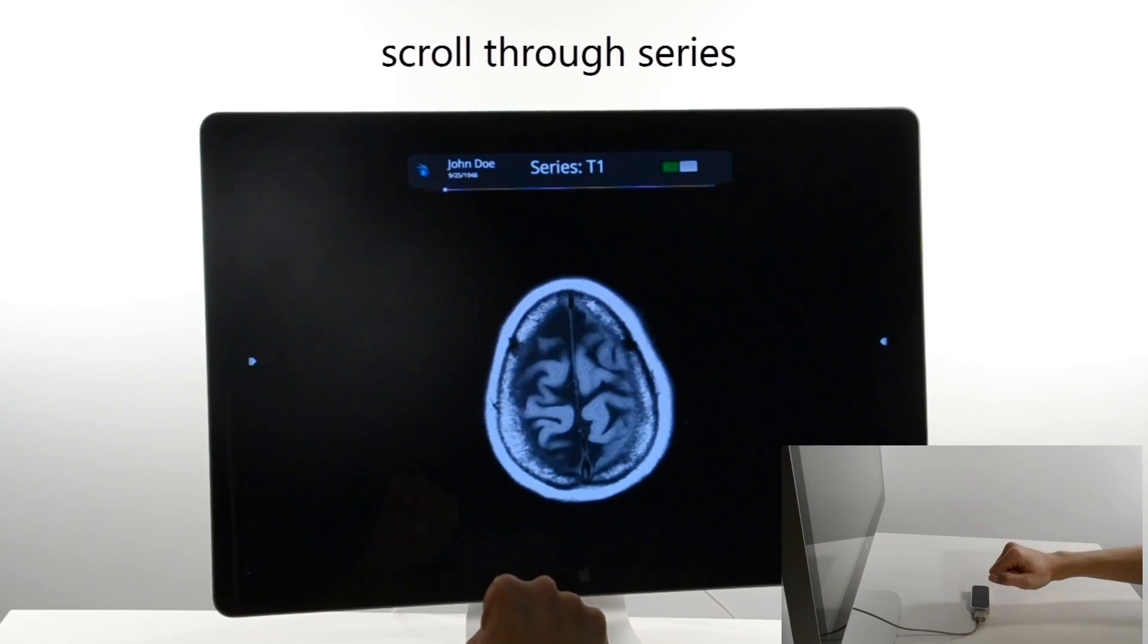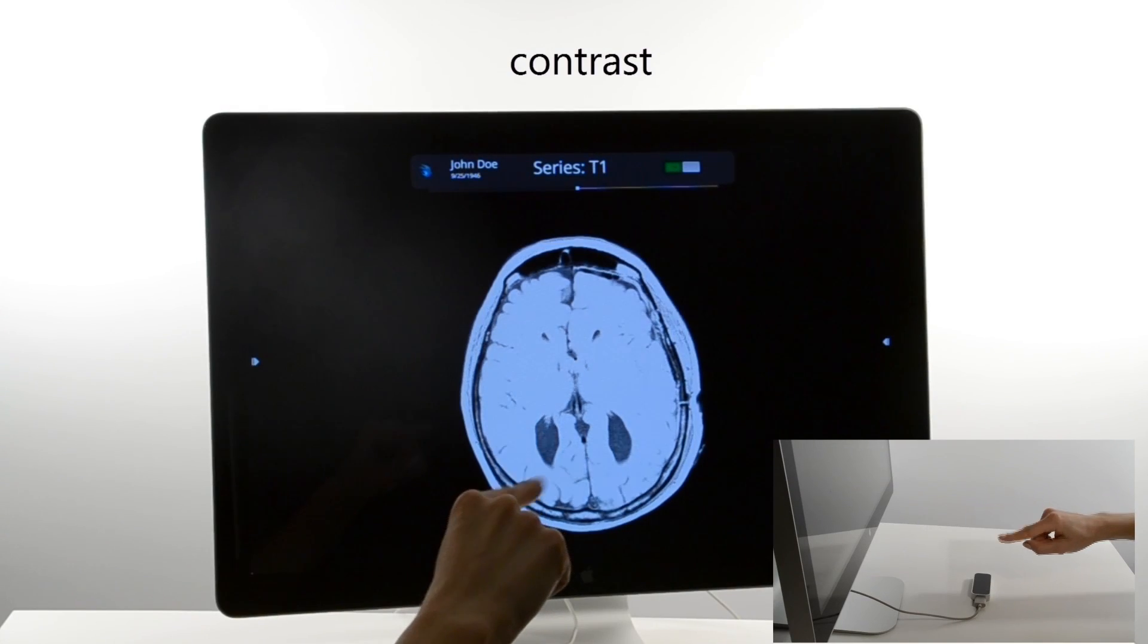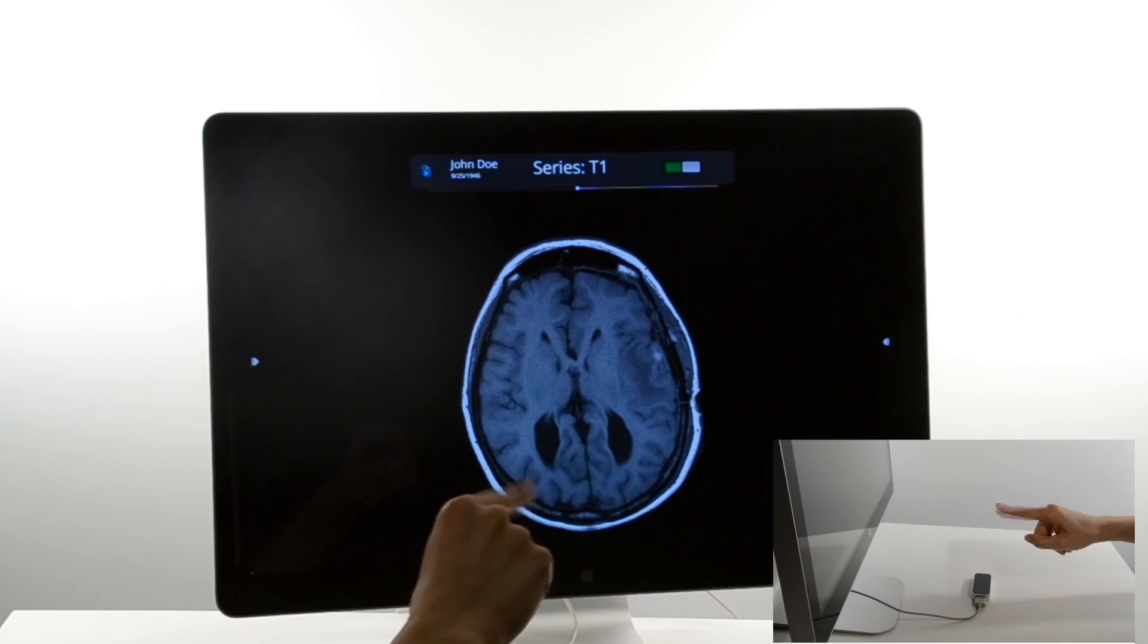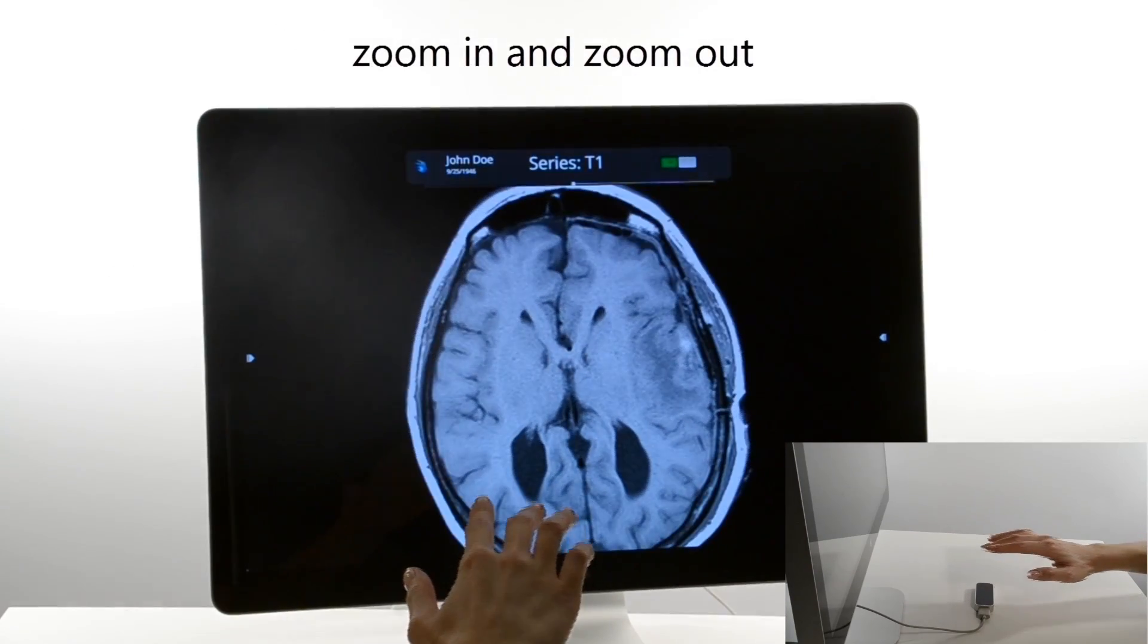The interactions with the viewer are encoded in the form of hand gestures. For instance, you can use your closed hand to scroll through a series of images or simply rotate your finger clockwise or counterclockwise to adjust image contrast. You can use your palm to zoom and pan the image.